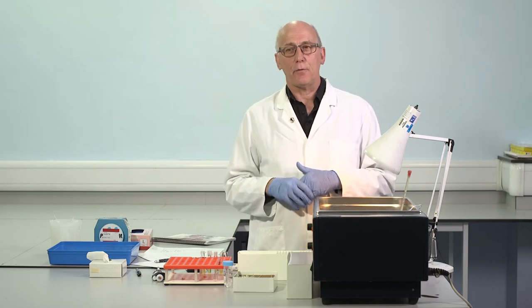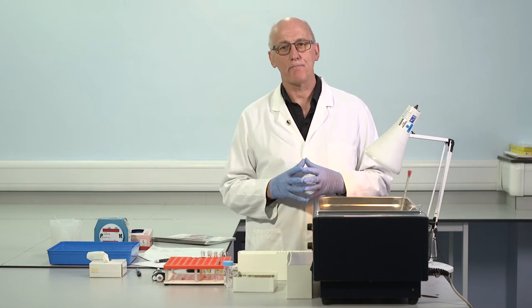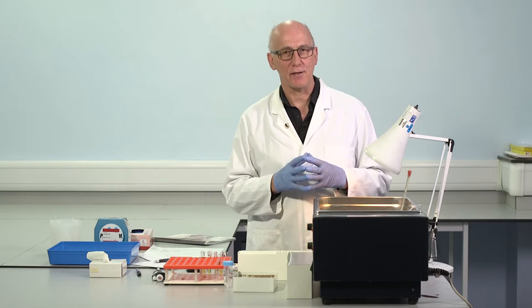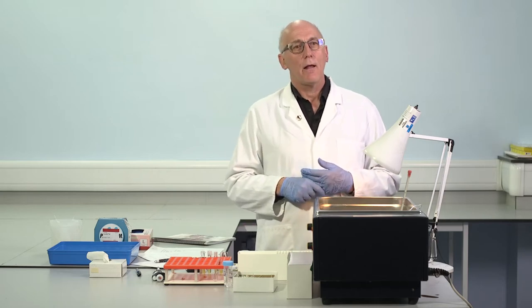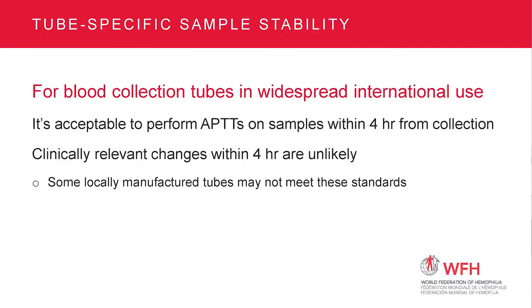In terms of the patient samples, we absolutely have to pay attention to the stability of the sample. And we know that tests like APTT will change over time as the sample ages. We will begin to lose factor 8 at some point, and that might be a tube-specific change. For most of the currently used blood collection tubes, it's acceptable to perform APTTs on a sample within the first 4 hours from collection to testing. So it's unlikely to be a clinically relevant change in 4 hours.